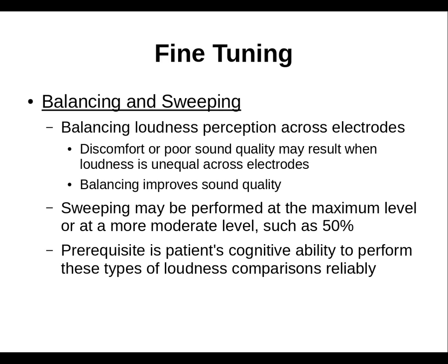But just like with hearing aid fitting, just measuring pure tone thresholds and loudness discomfort levels, for example, doesn't always get you to where you need to be. With hearing aid patients, we know that we may need to adjust gain or the frequency response to make them more desirable for the patient in the long run. So fine-tuning is also going to occur with cochlear implants. Balancing loudness perception across the electrodes is going to be one important thing to do. So you have different electrodes.